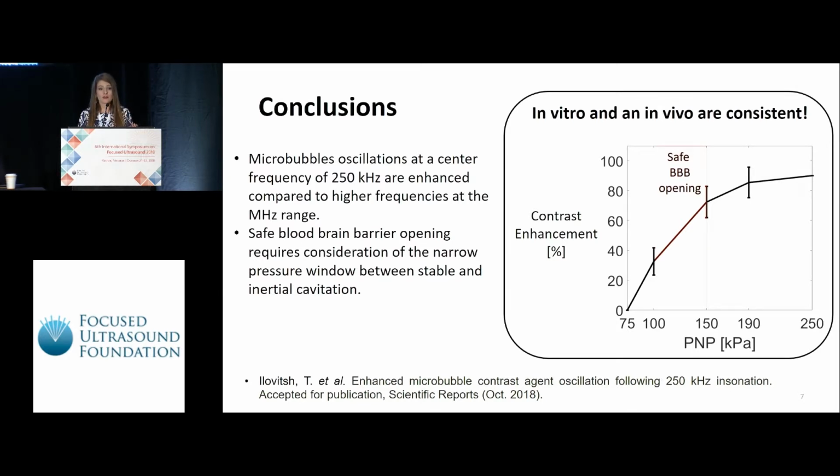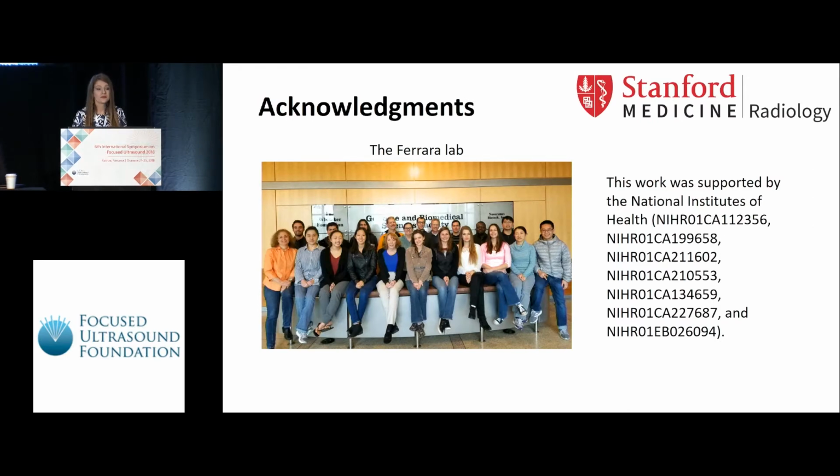And the take-home message from my talk is that for our setup and our configuration, safe blood-brain barrier opening is feasible. However, it requires consideration of the narrow window of pressures between stable and inertial cavitation. And these results were accepted for publication 4 days ago in Scientific Reports. Thank you.